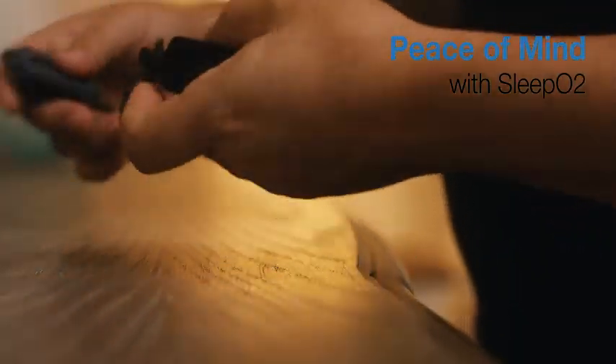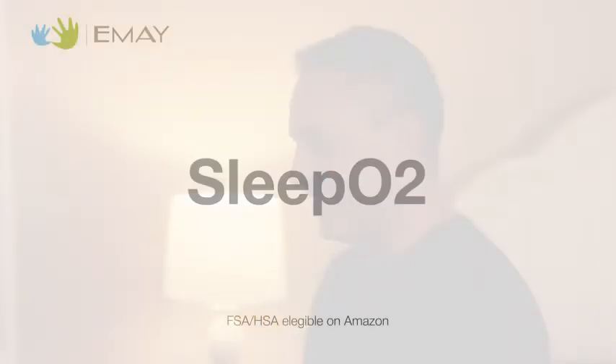SleepO2 — the ideal sleep oxygen monitoring system made just for you.